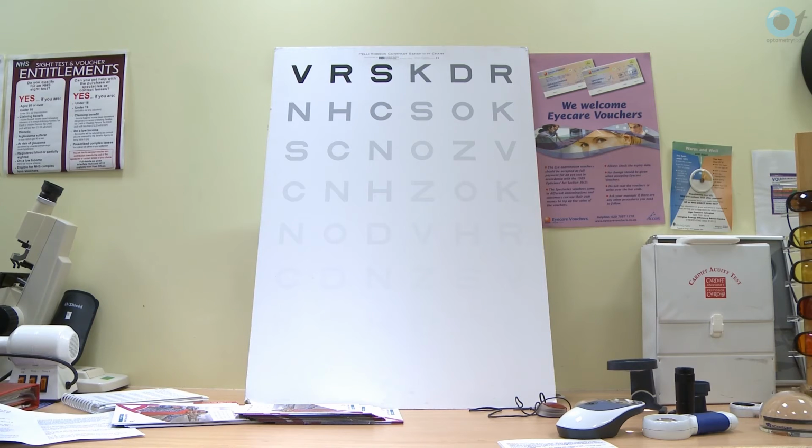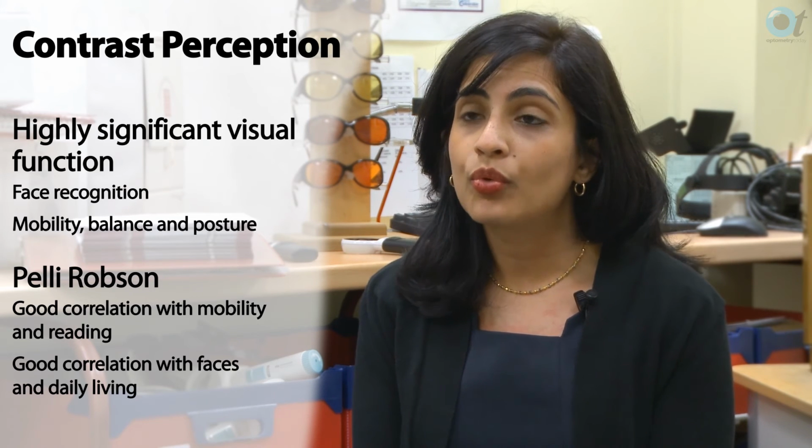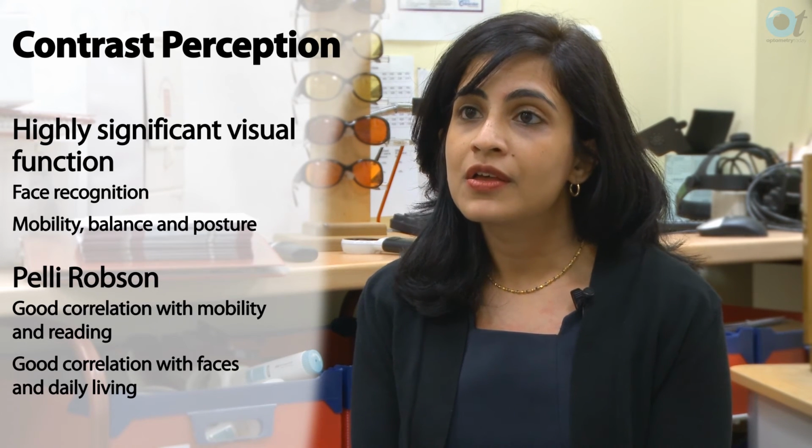So here at Action, we use the Pelli-Robson, and this chart, when used at 1 meter, is designed to assess contrast sensitivity at the peak of the contrast sensitivity function curve and is best placed to correlate with activities of daily living where we know contrast sensitivity can be an issue.